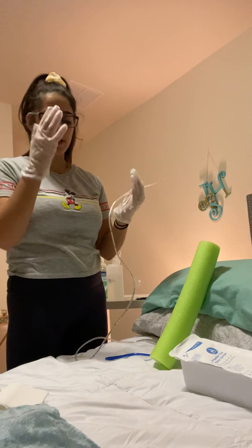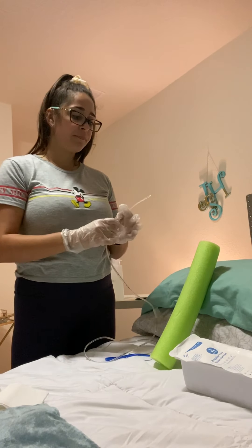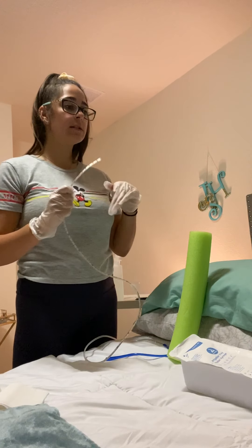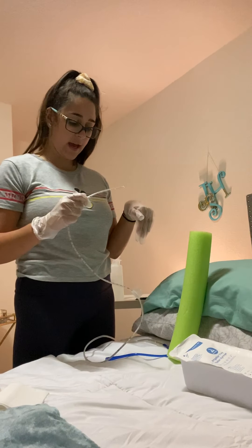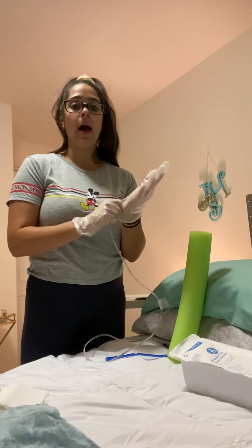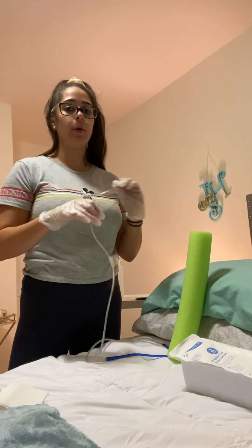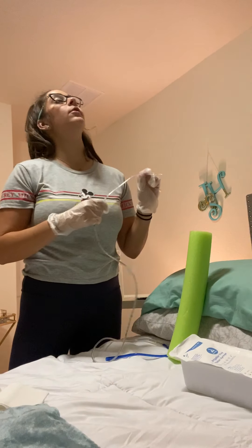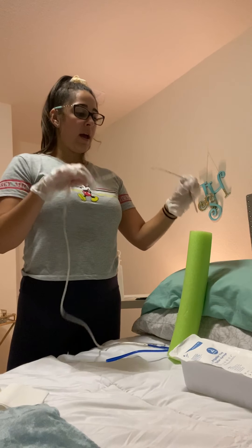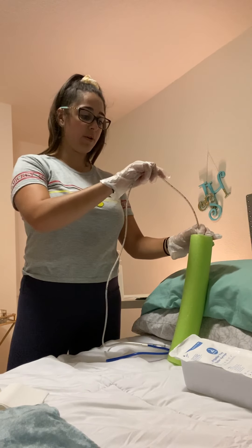I'm going to let my patient know I'm ready to start the procedure. I'm going to have them bend their head towards their chest. I'll let them know to take small sips of water that I'll be giving them and swallow while I'm putting the tube down their nostril. I'm also going to let them know to breathe through their mouth. I'm going to insert the tube into their nostril, directing it to the back of the throat towards the ear.